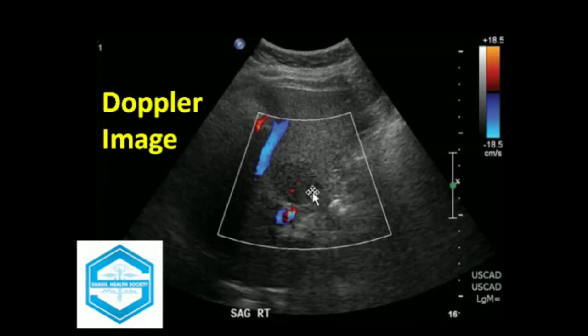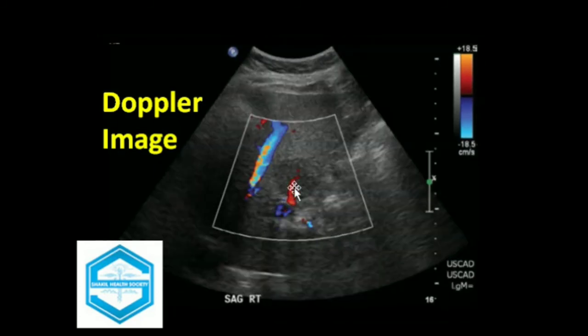It was concluded to label this mass as focal nodular hyperplasia, as it shows flow in its center and other findings related to hepatitis C are not present. Further work with CT scan and MRI are required to confirm the diagnosis.